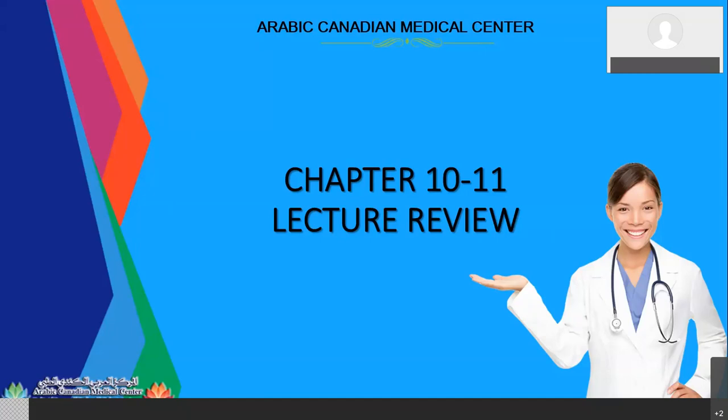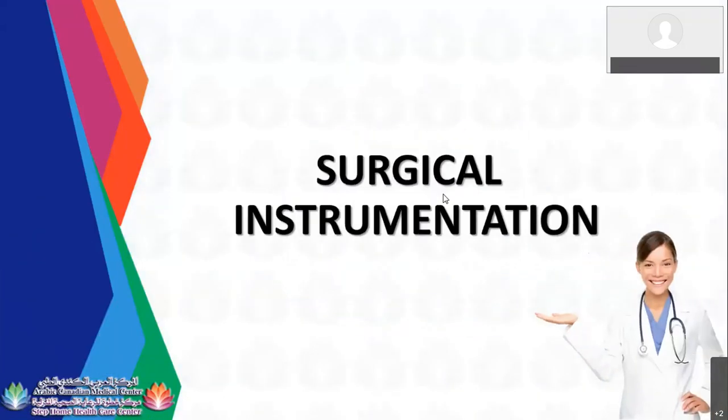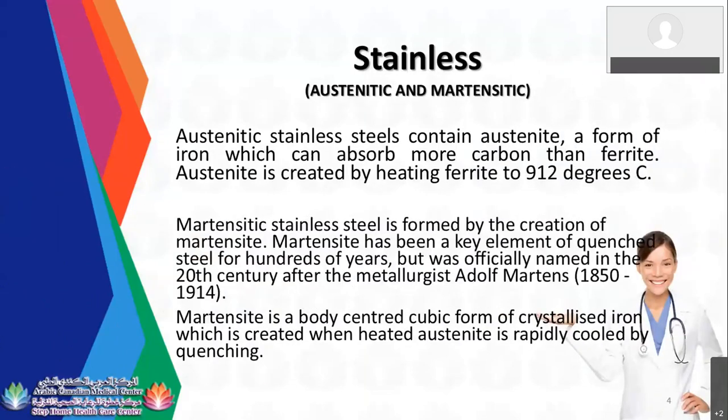So now we will have our lecture review for chapter 10 and 11. For surgical instrumentation, in the OR and medical facility, most surgical instruments or medical equipment are all stainless steel. There are different types of stainless: 300 stainless, 400.